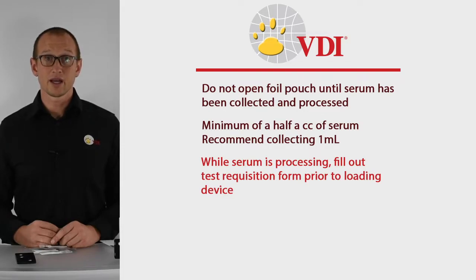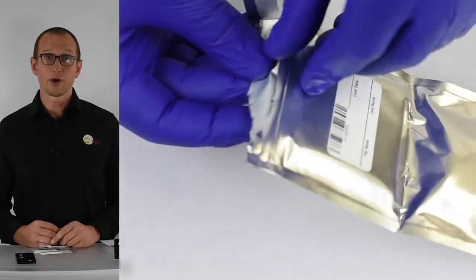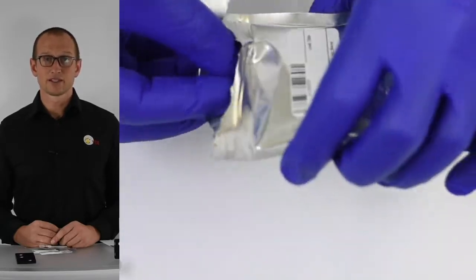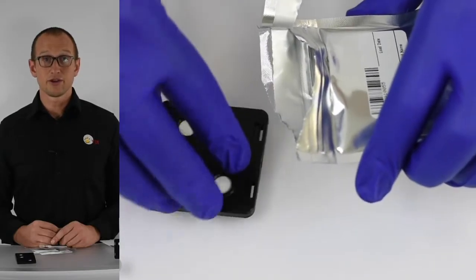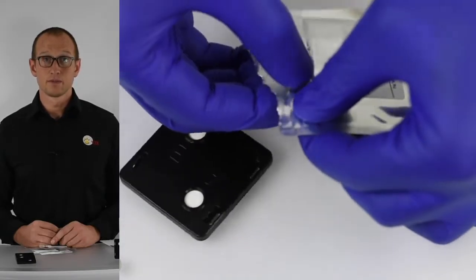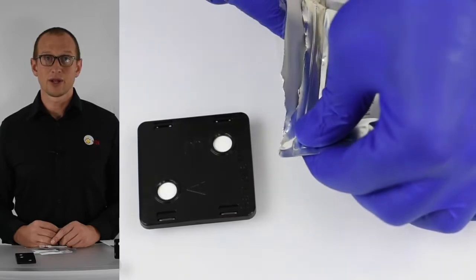Once serum is ready and the requisition form is filled out, open the foil bag and remove the dried serum device. It's best to reseal the bag after removal. The device has two wells labeled A and B.